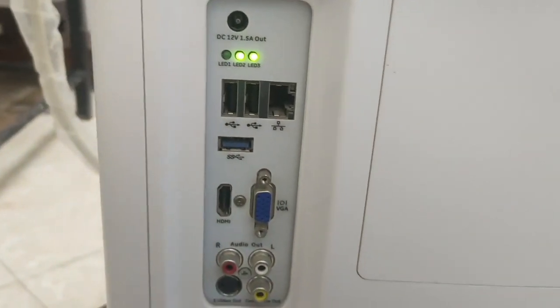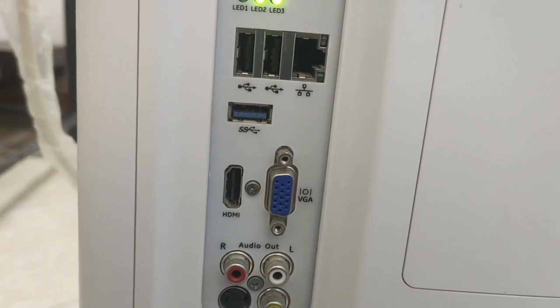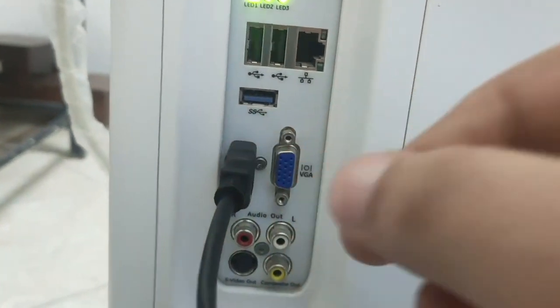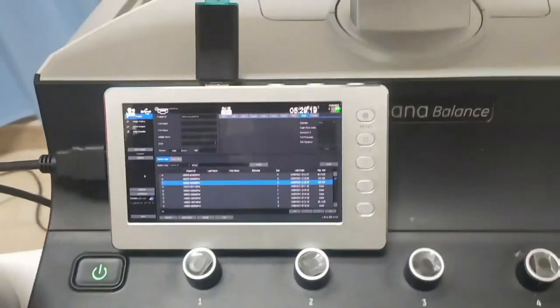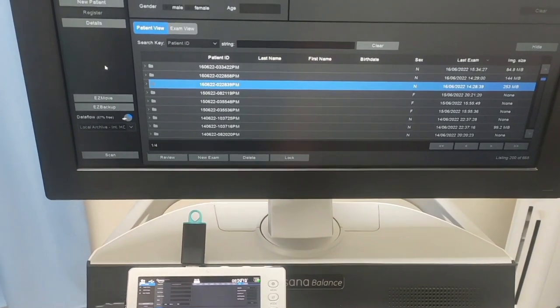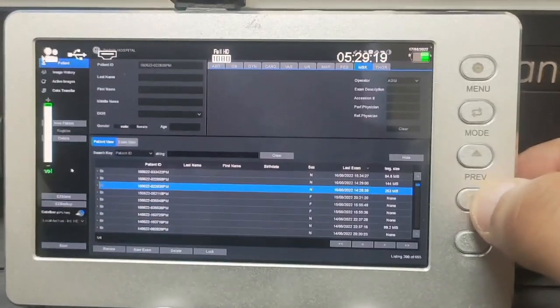Now, connect the other side of the HDMI cable into the HDMI output of the ultrasound machine. Now, the screen of the ultrasound machine is seen on the screen of the capture device. You can start recording from the ultrasound machine by pressing the OK button of the capture device.